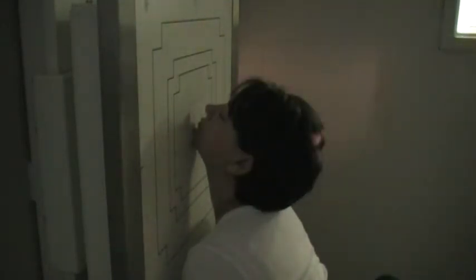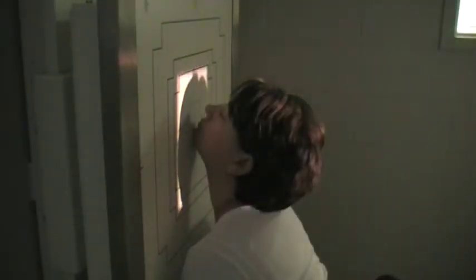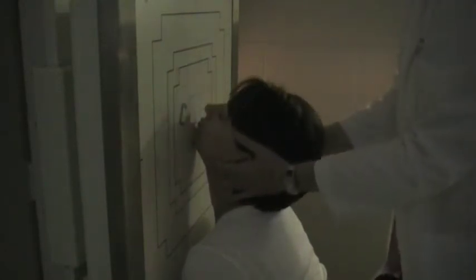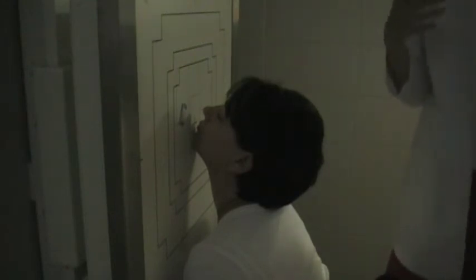For the central ray, you want it exiting at the level of the acanthion. This is the left side of the head, so I'm going to place my left marker up here. I'm going to bring your chin down just a tad. If you have the head tilted too far back, that's going to foreshorten the orbits so you don't see them as well.